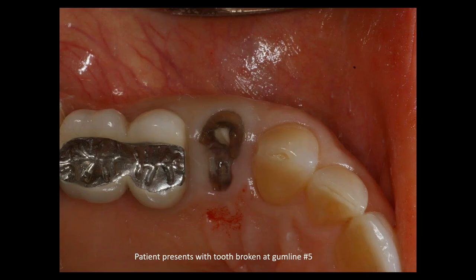This patient presented to my practice complaining that the crown and core restoration broke off several weeks prior. Although the patient didn't have any pain, they knew that this area needed to be addressed because there was a foul odor coming from this broken off root tip. So this patient definitely wanted to get this root extracted and have this area replaced.